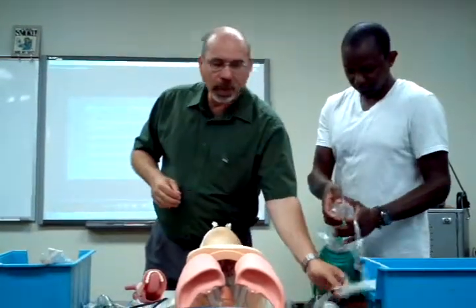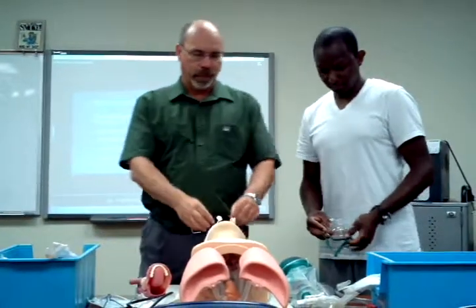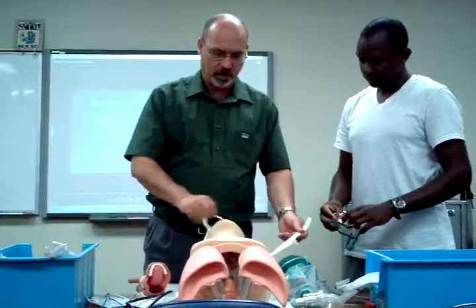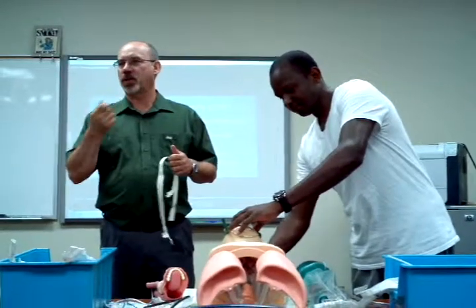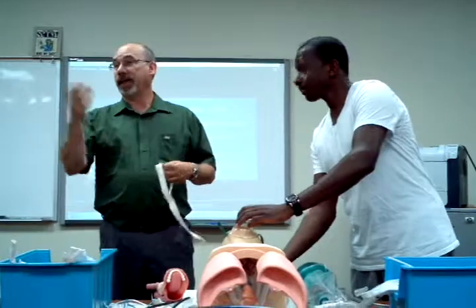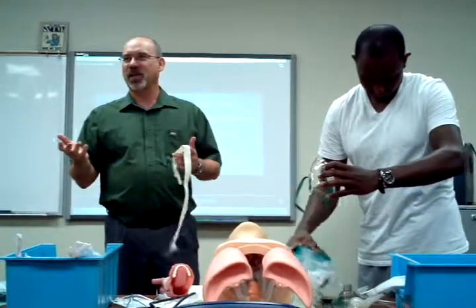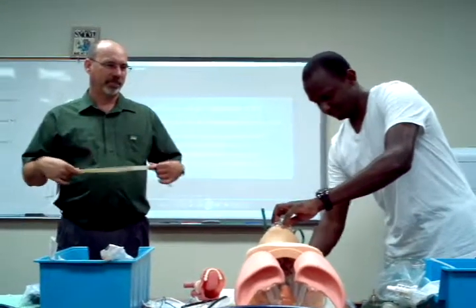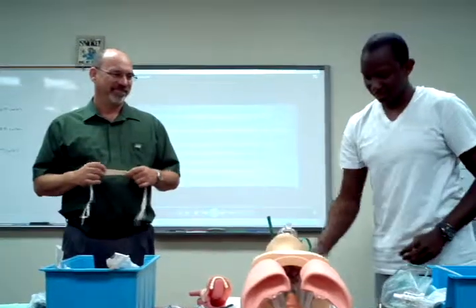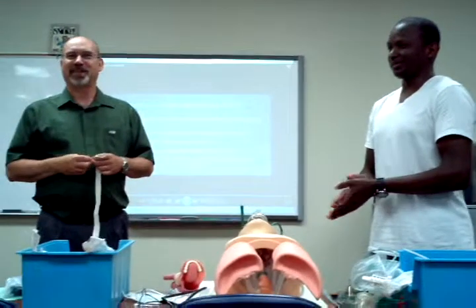Assessment after I'm done: auscultate, check for stridor, pulse ox. I'm going to finish taking the tape off. Robert's going to apply the oxygen. You're almost always going to have to use the Yankauer to suction right after you pull the tube out. And if it was a long-term intubation, I like to look down the ET tube and see if there are any plugs — just for future reference. Questions? I almost want to do that over again because I don't like how that went.